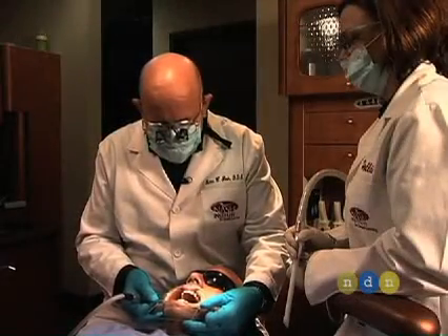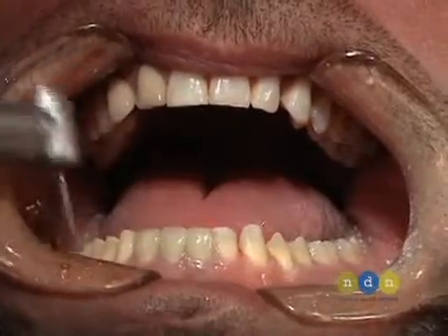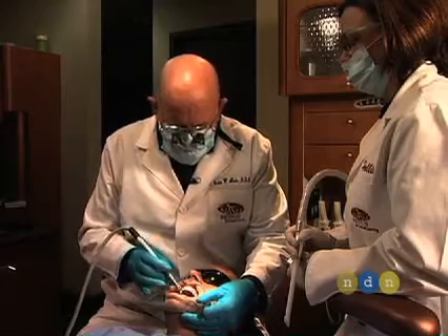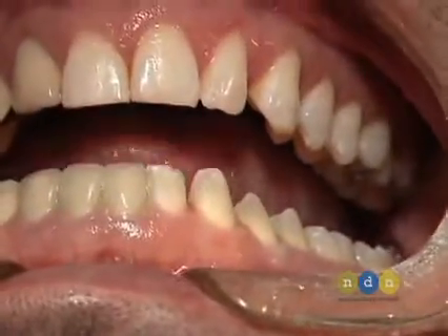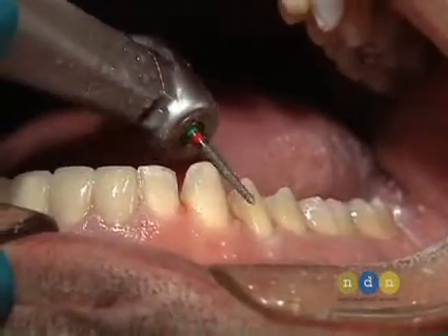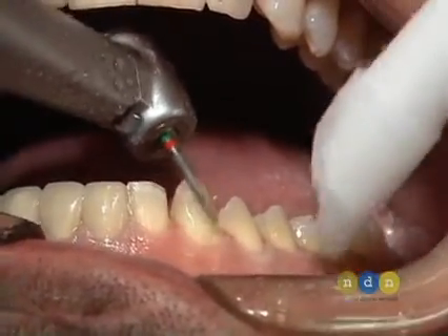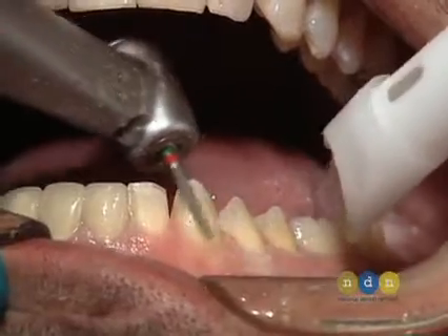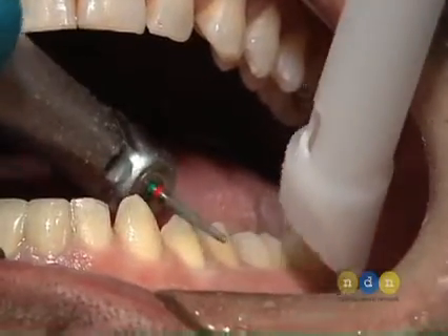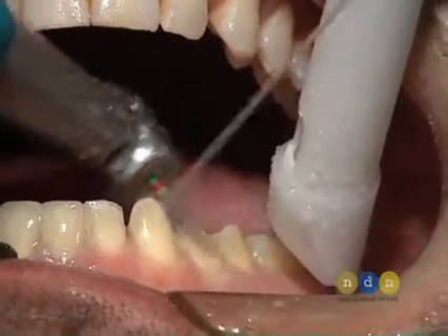So we've reduced half a millimeter from the facial surface of the lower premolars, canines on both sides, and the lateral incisor on the right side. I basically just got a straight vertical preparation — of course the teeth have different angles. I'm going to contour the canine over the incisal edge just a little bit to have that second plane of reduction, so that we have enough room for half a millimeter there. Same with the premolars — follow the contour of the tooth.